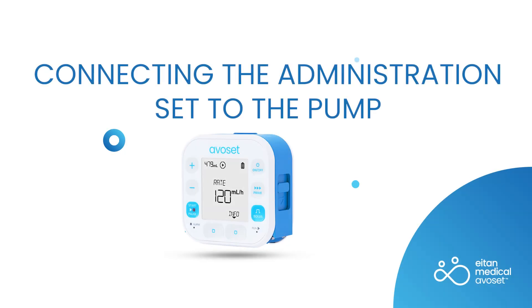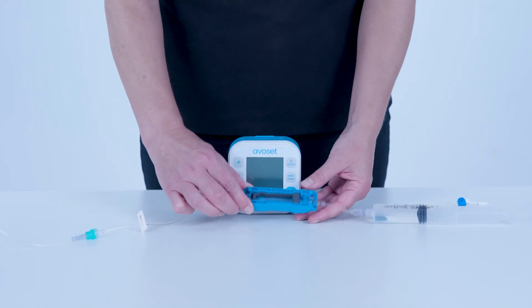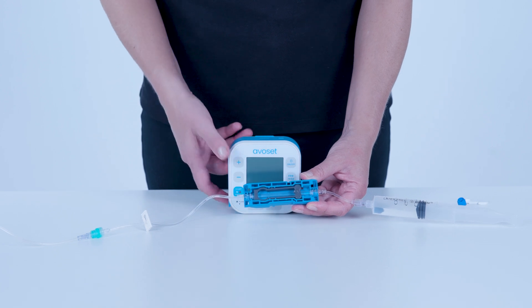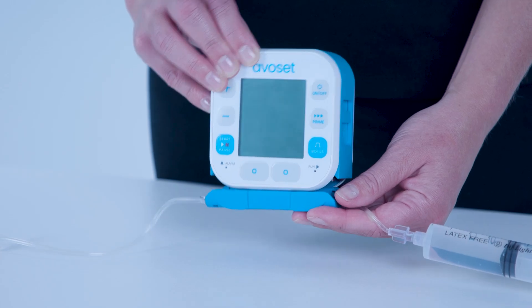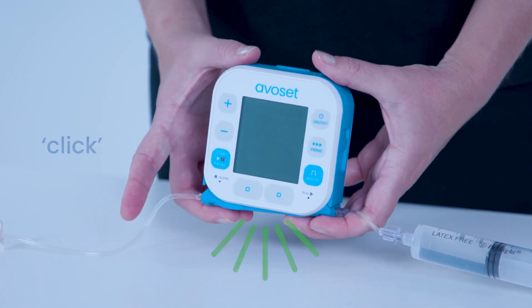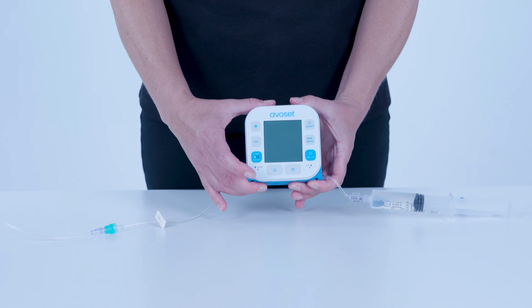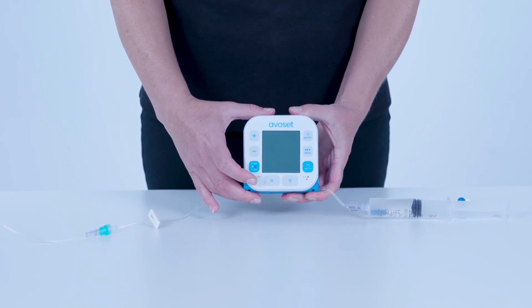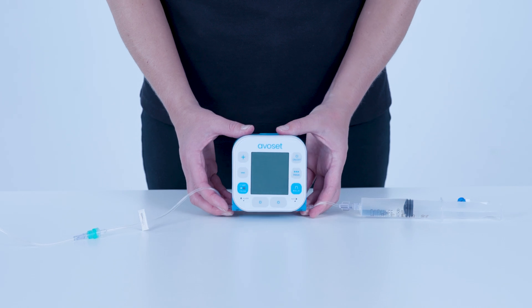To connect the Administration Set to the pump, remove the white clip and position the Administration Set underneath the pump. Gently push the cassette into the pump socket. You should hear two clicks indicating full engagement. Verify that it is securely attached. The line is now ready to be connected to the patient.